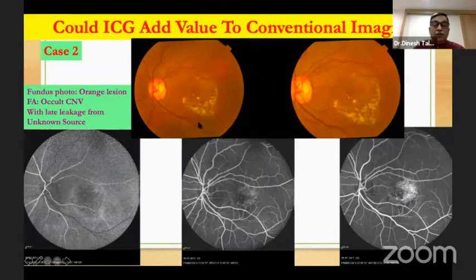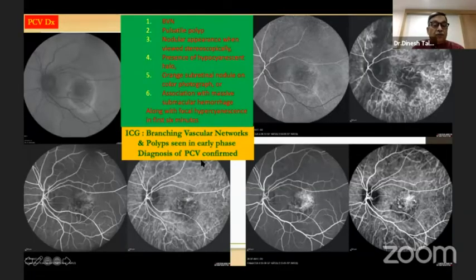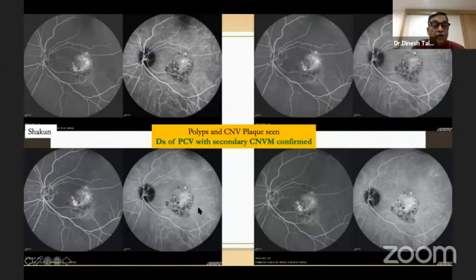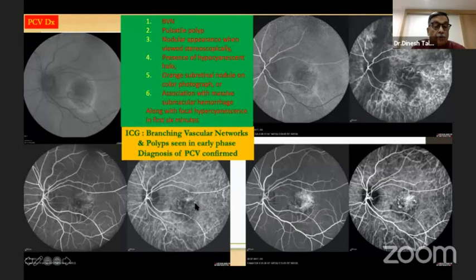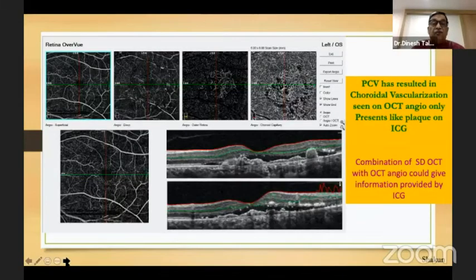Here is a patient with a lot of exudation. The FA only shows late leakage from an unknown source. The OCT is quite characteristic — a peaked PED with shallow underlying RPEDs and a double layer sign — all signs of PCV. When you do the ICG, you can see the branching vascular network and one or two small polyps. In the late phase, there is also a plaque lesion, indicating PCV has progressed to CNVM formation as well, which is confirmed by OCT angiography.